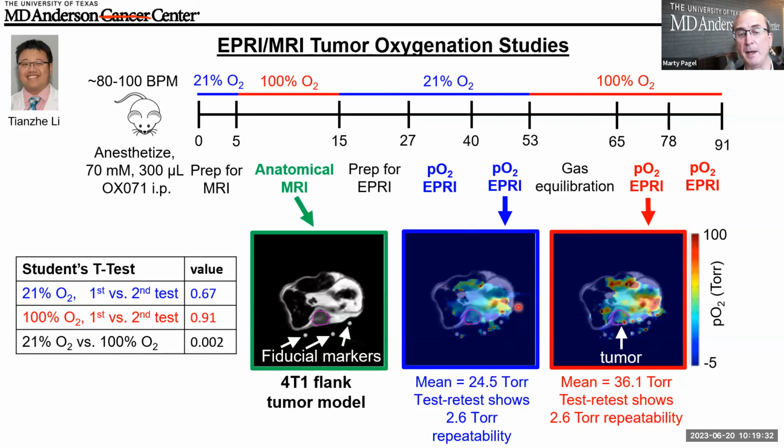And here's a PO2 map. And well, I like to very affectionately call this a blobogram. It reminds me of PET imaging, where you see signal everywhere the agent has gone, and you really don't have anatomical information. You only see where the free radical is, right?